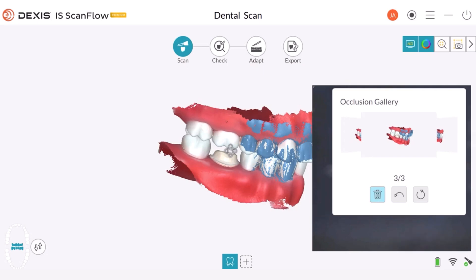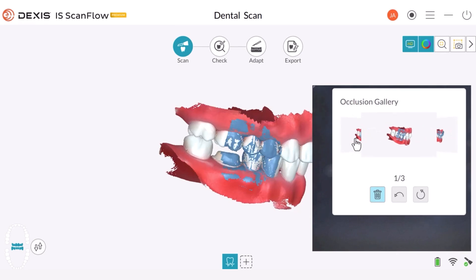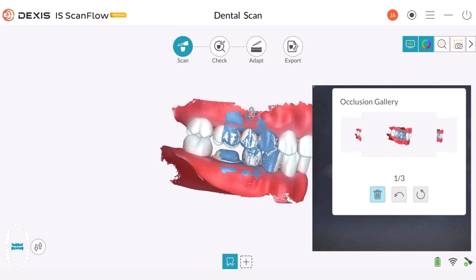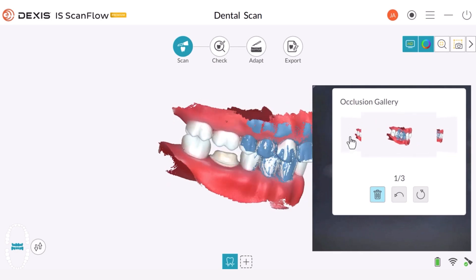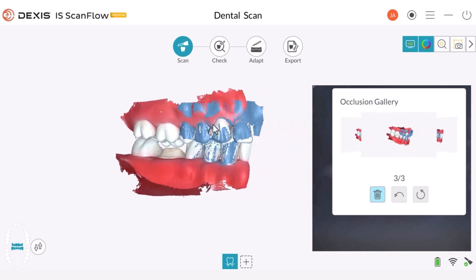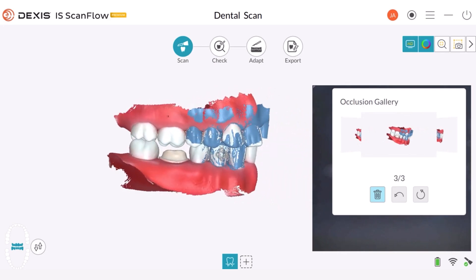For a quadrant, it's important to obtain three buccal bite scans. You can review these scans using the occlusion gallery. The first scan is here, the second one is here, and here is the third scan. The blue area represents the data that were used to capture the third bite. It's important to capture each buccal bite across the quadrant, as this provides multiple reference points for the software, which will average these bites together.